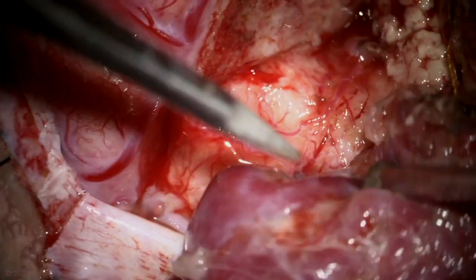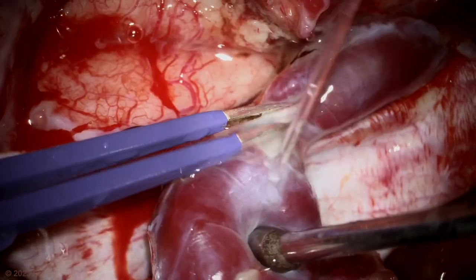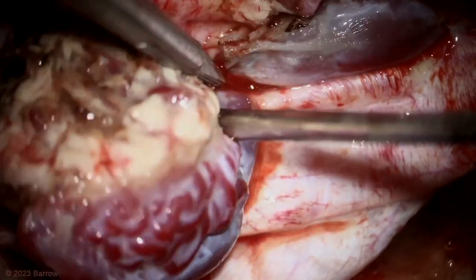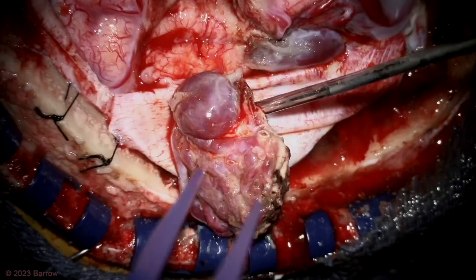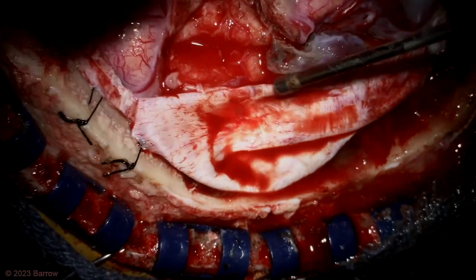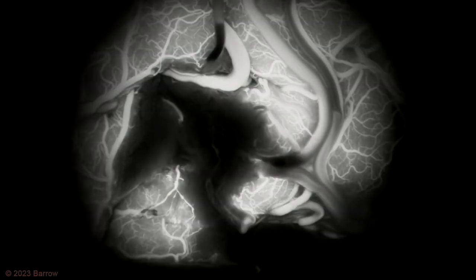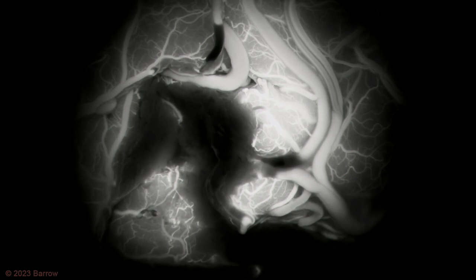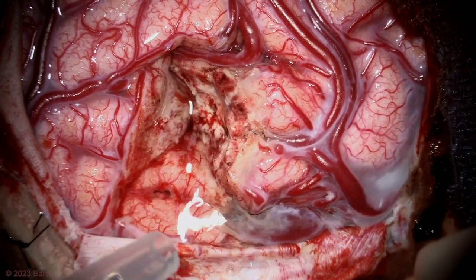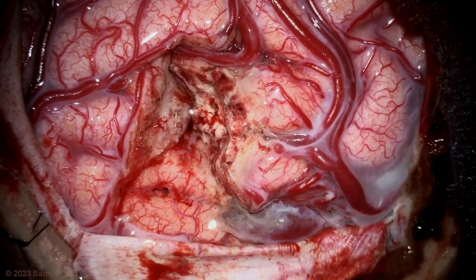The AVM is rolled out completely now, and all that remains is this large vein keeping it connected to the brain. I'm using my cautery to shrink the vein. By shrinking it, I can now transect it, and now the AVM is completely free and I can remove it. You can see a very clean dissection with preservation of that somatosensory cortex, and indocyanine green shows that there's no further shunting in any of the draining veins. The final overview shows that the one plane of dissection through the parenchyma was on that anterior border against the somatosensory cortex.